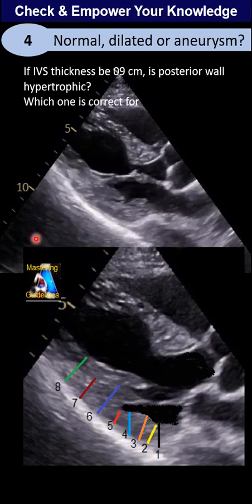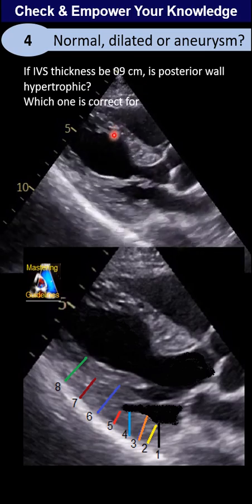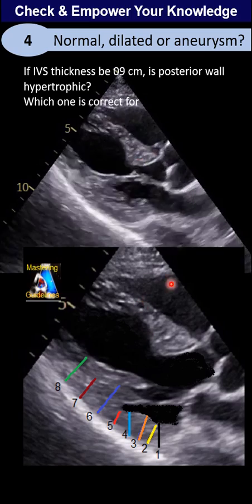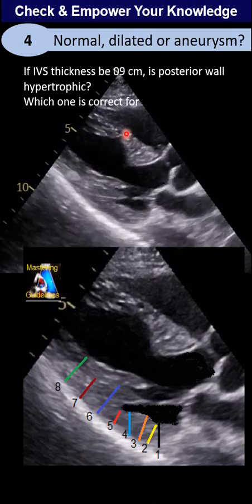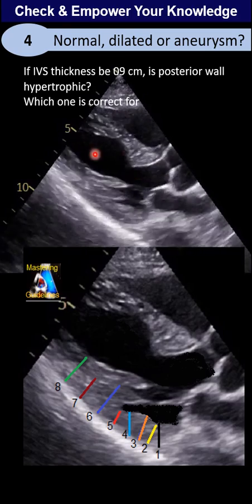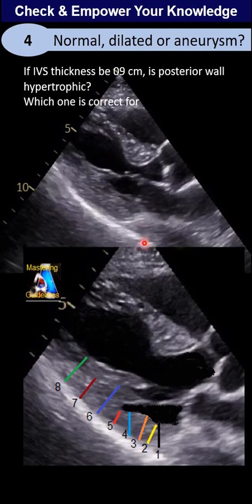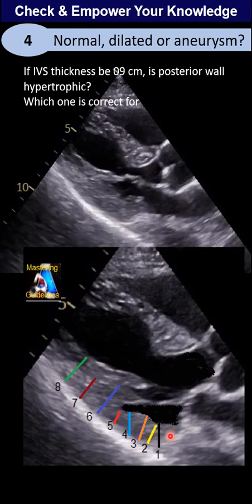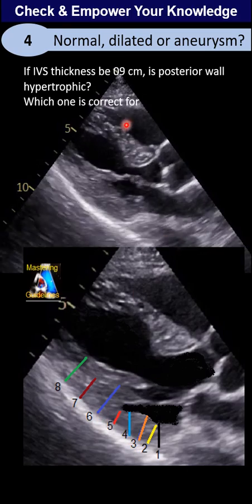If we measure at the IVS at the mid-septal level here — not at the sigmoid, because we have a prominent sigmoid septum — and we measure 0.9 centimeters, do you think this patient has left ventricular hypertrophy or not? Second, which spot is the correct measurement for the posterior wall? You have to correspond it with the 2D frame.